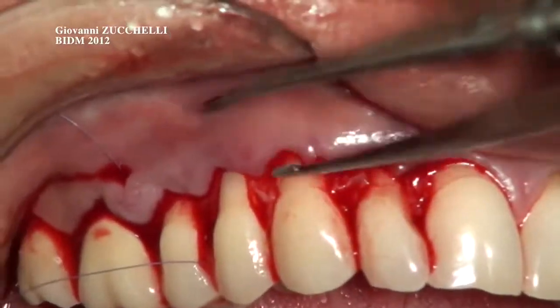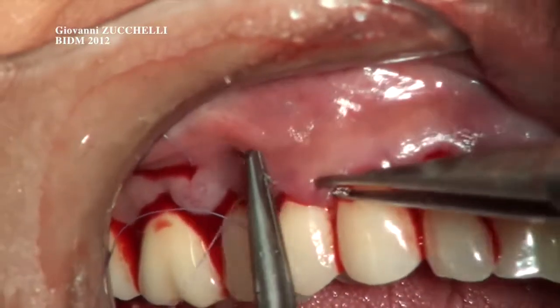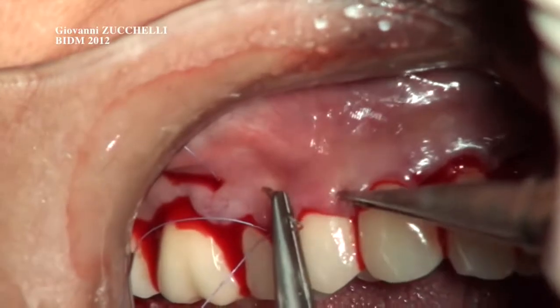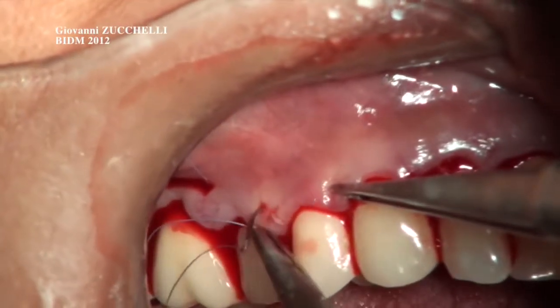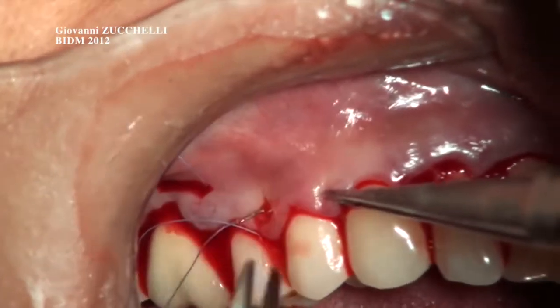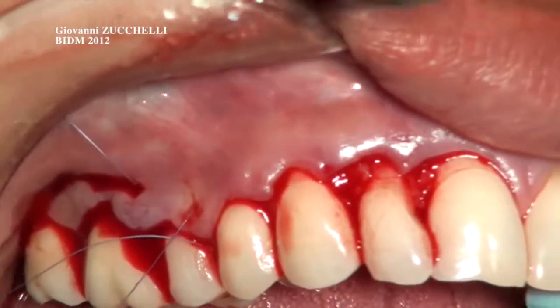The papilla in the buccal aspect, please keep here. Now you take the papilla in position, gently, and when the papilla is in the right position, you perforate surgical and anatomic papilla between the two premolars and go back in the palatal aspect.